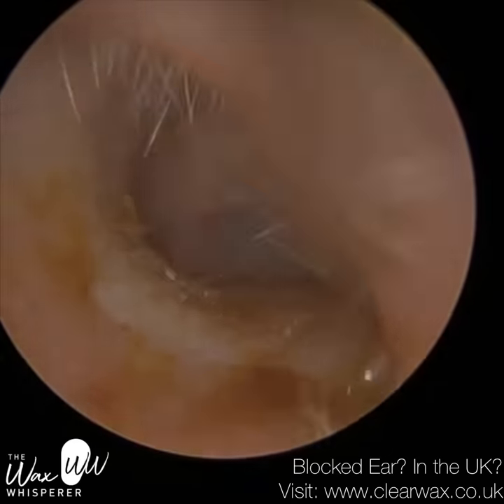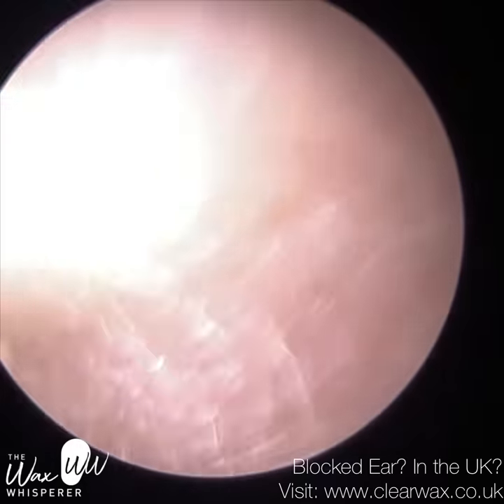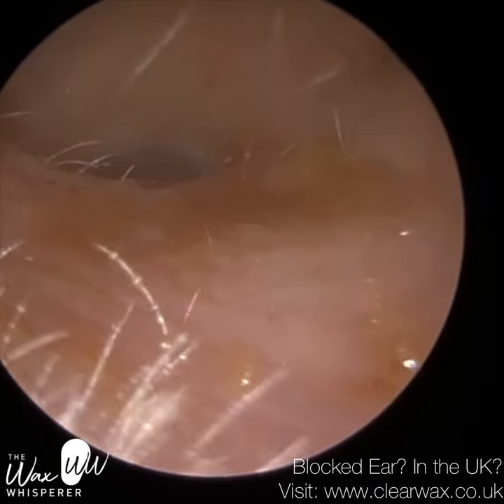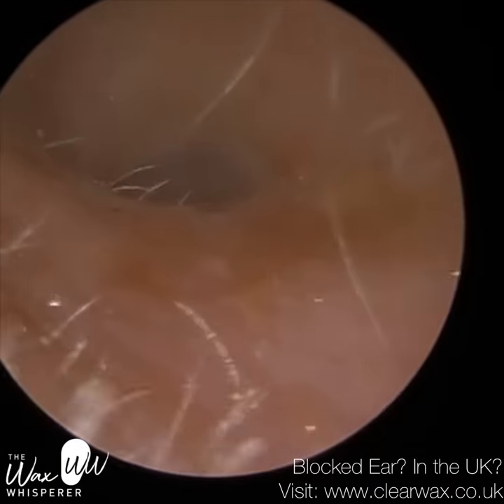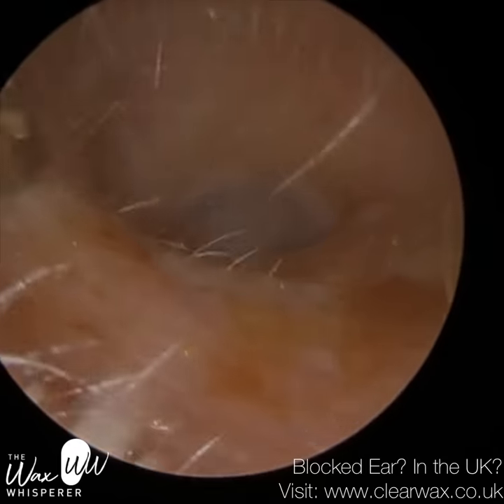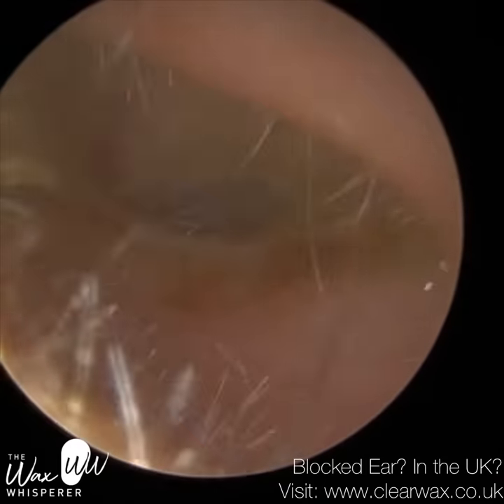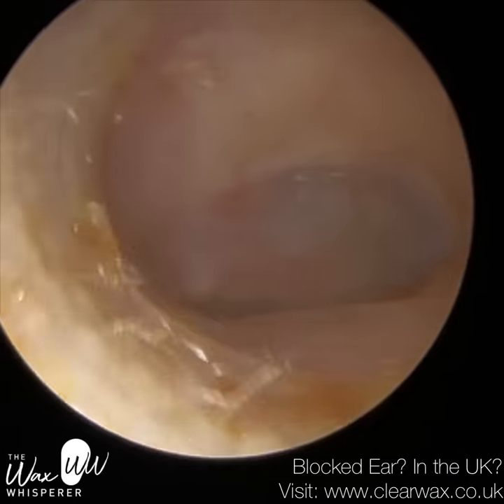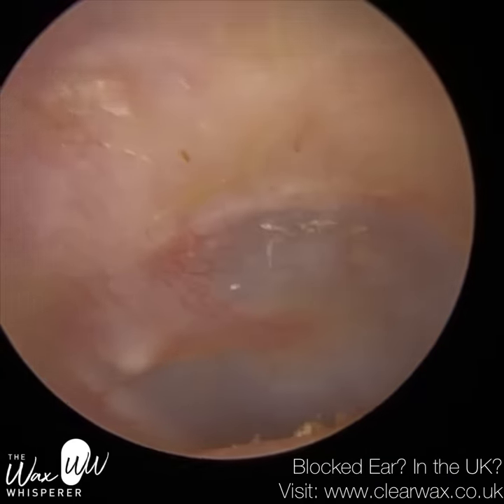There we are. So I'm just going to mop up the cartilage portions. We've got some of the sticky wax that stained the canal wall. Here we can apply a bit of pressure to the cartilage. It's not uncomfortable for the patient. If we were doing this on the bony part, we wouldn't be able to do that because it will just be too uncomfortable for the patient, and they'll be screaming at the top of their voice.